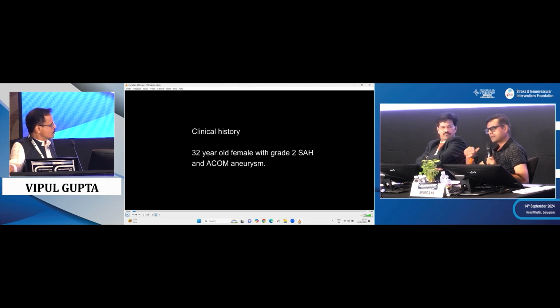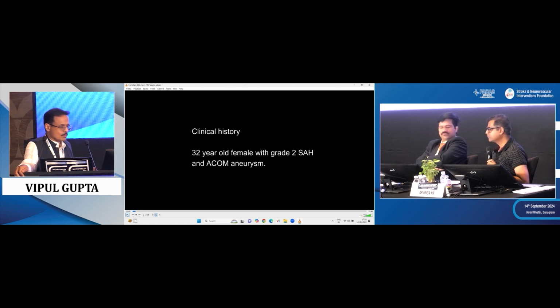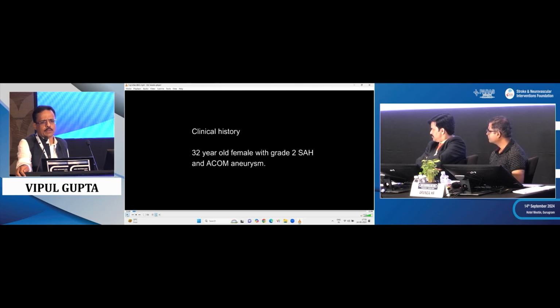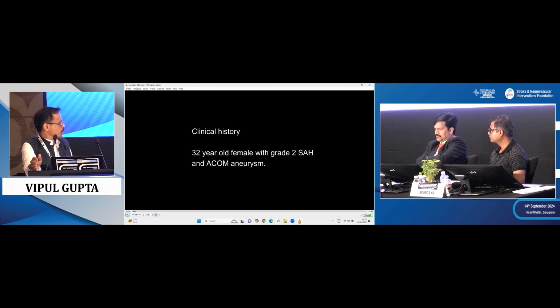So it's my practice, almost every case I put the patient on aspirin. Yeah, that is useful when you are doing such kind of packing near the neck. Even if a coil tip is not hanging out, clotting can happen. So number one, same thing. We increase the heparin, we watch for any clotting, and after extubation, we give them aspirin and give it for a few weeks, and that usually suffices.